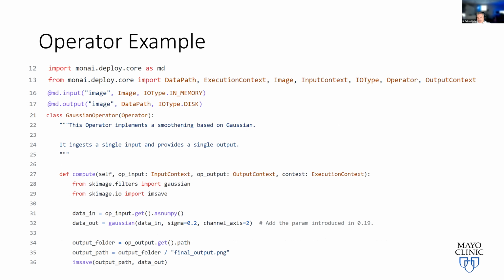Then let's jump into some quick examples. Dr. Gupta, would you like to go through the examples here? Yeah, hi, Sanar. I can walk through the examples, and I was setting up a demo to show, so I can show some demo as well. So yeah, thanks, Sanar, and also sorry about the delay. I had some things that I couldn't escape.